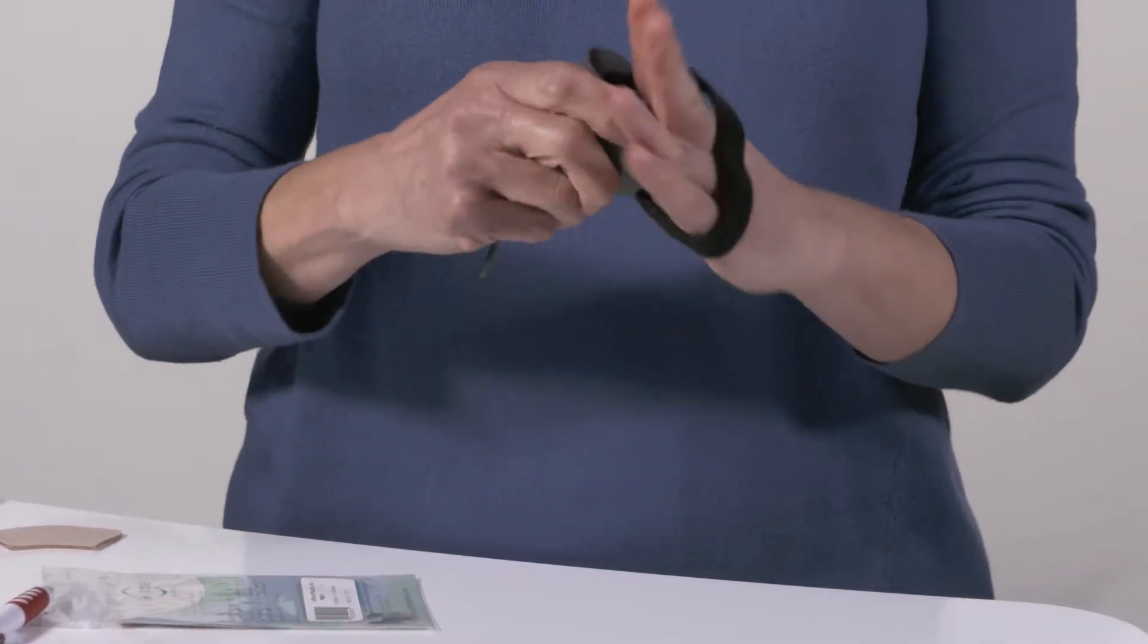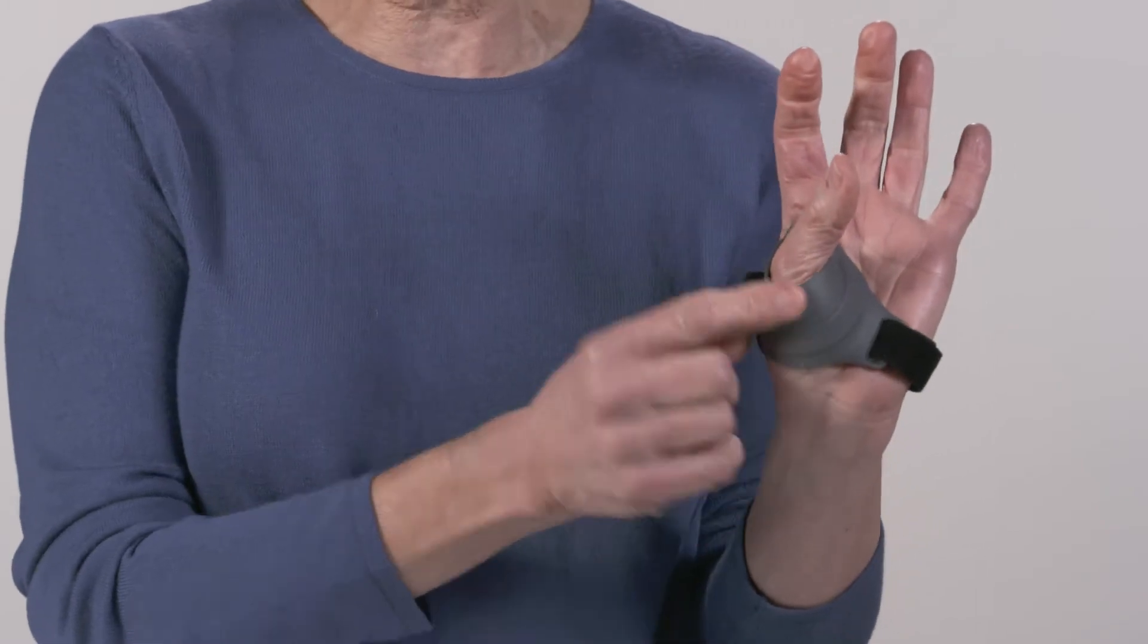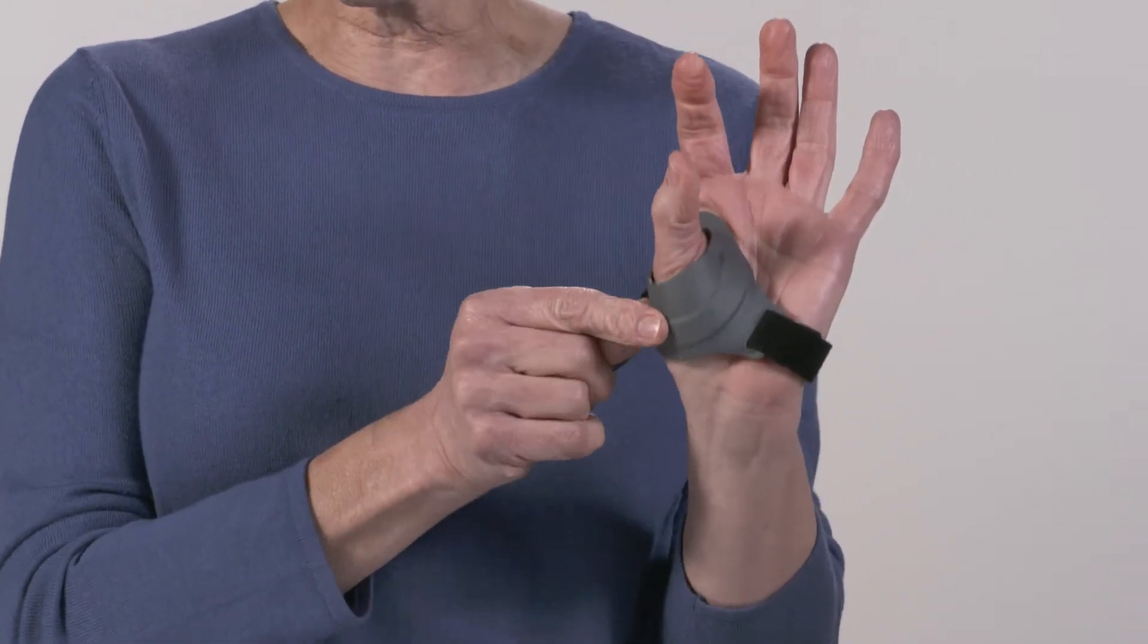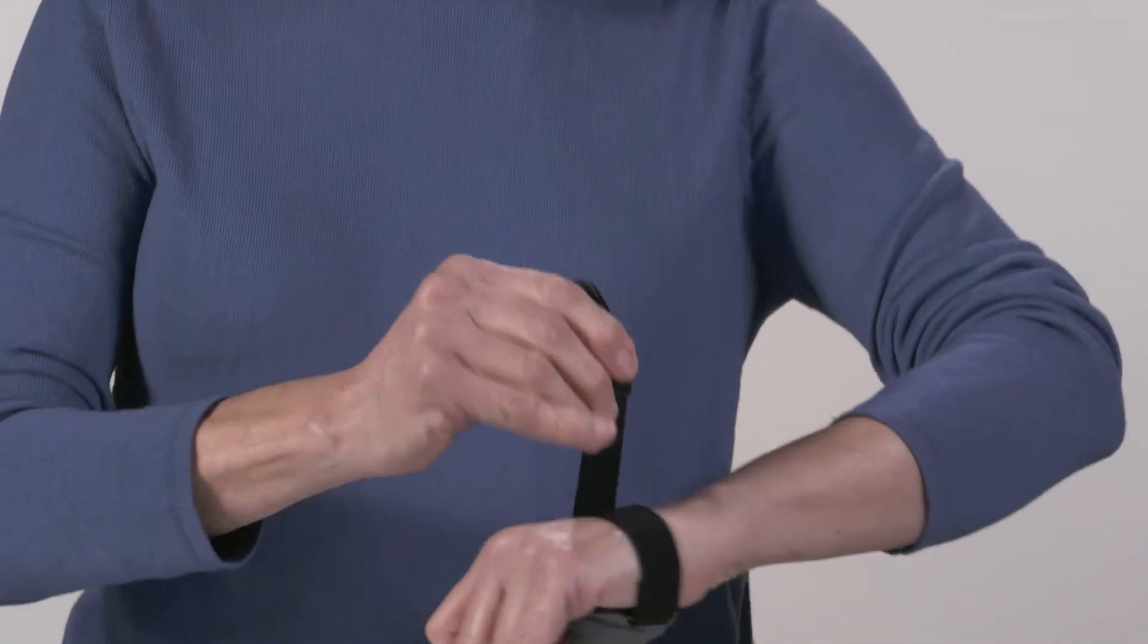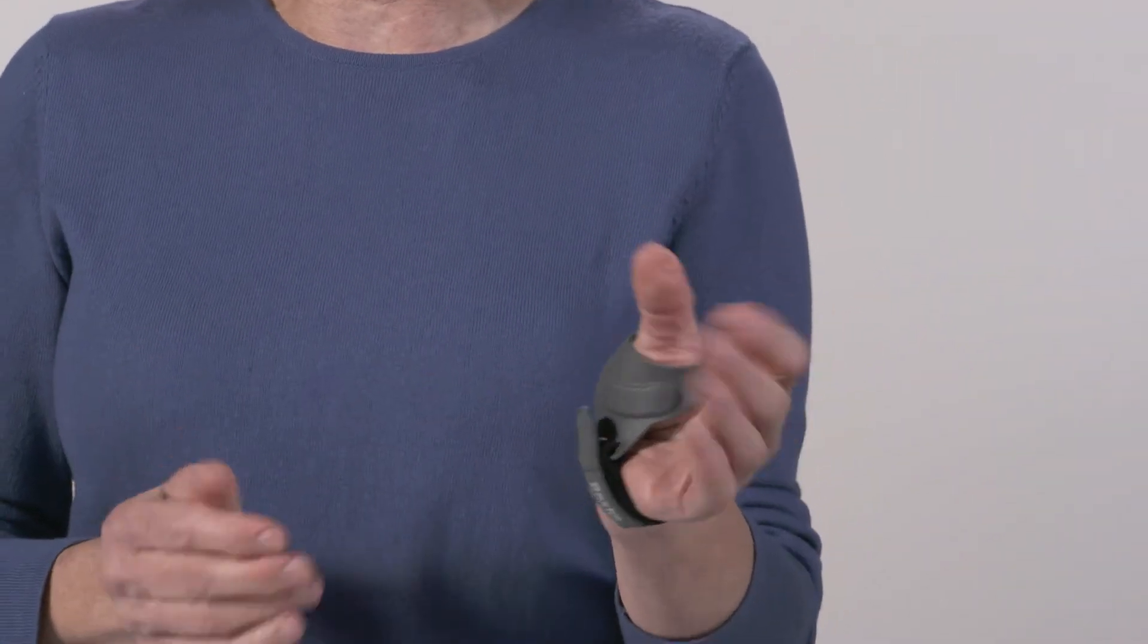And now when you go to put your brace onto your hand, you're going to find a nice soft cushion over the bony prominences of your thumb so you get a softly cushioned comfortable brace you can wear all the time.